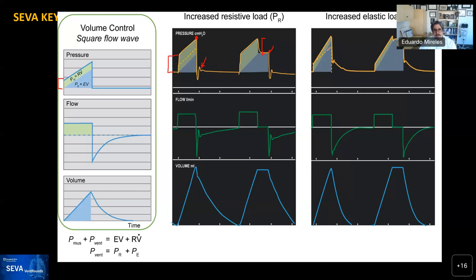On the other waveform — increased elastic load — there's a very small step up, but what changes is the slope. Instead of a gradual slope, you see a higher, steeper slope: the pressure changes faster for the given flow or volume delivered. When the breath ends, pressure drops. But there's another artifact: instead of dropping rapidly to baseline and reaching PEEP, it took some time to get there. This has to do with ventilator performance.